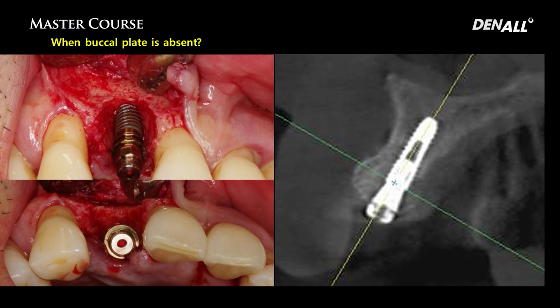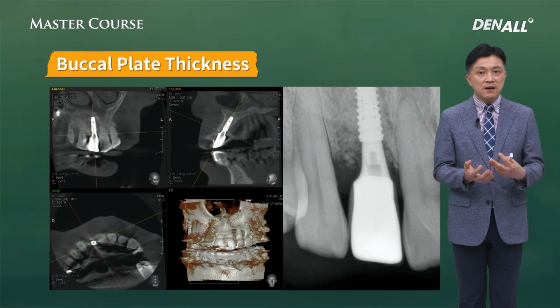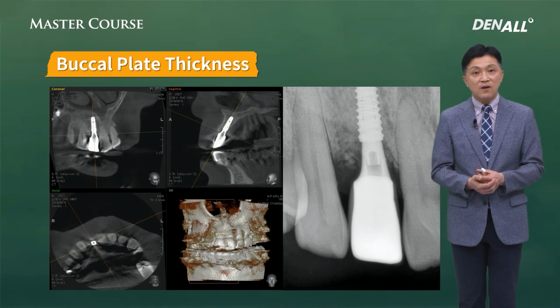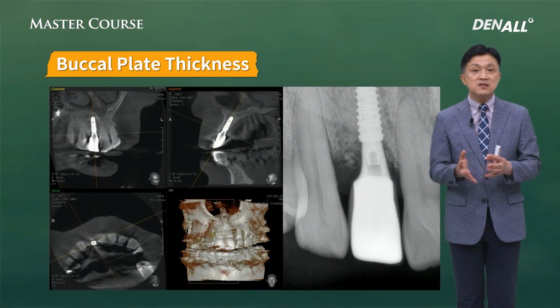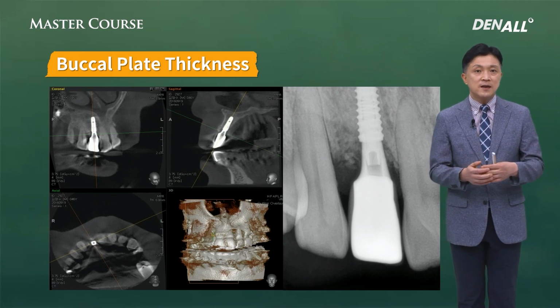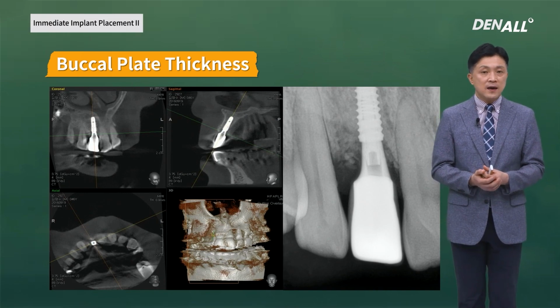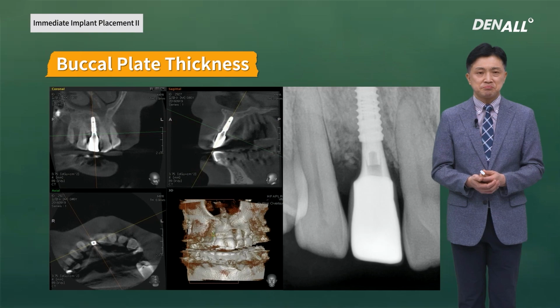It looks as if augmentation has been done significantly, but once it goes through remodeling process, because in the upper anterior area the amount of remodeling is significant, you need to use rigid membrane and do overgraft to withstand remodeling.